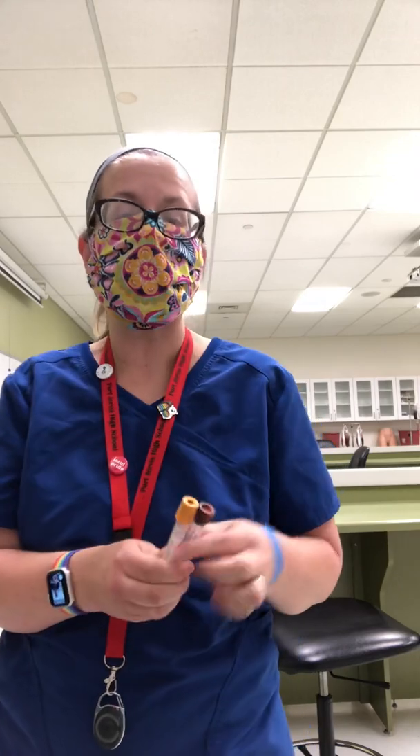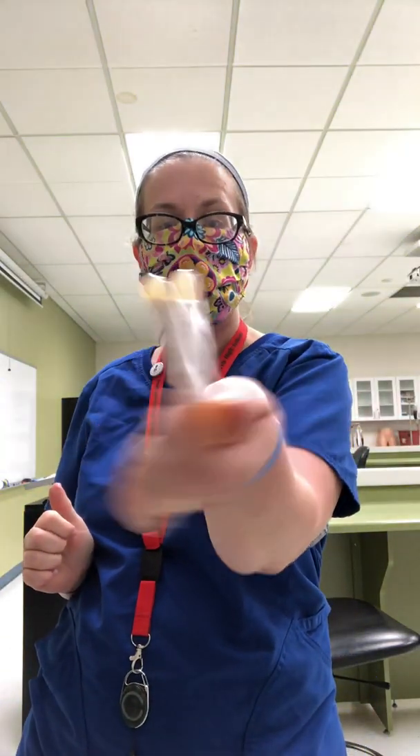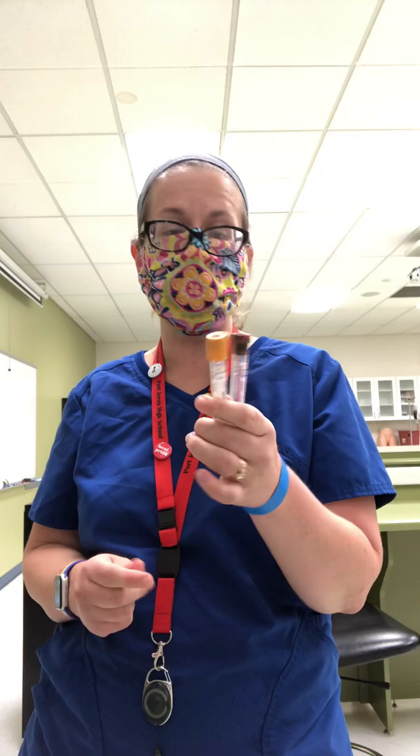Next are your gel tubes: tiger top, speckled, gold, and if you have the mint. These are serum separator tubes — you can see the gel in the bottom. Mint color is a plasma separator tube. Your chemistry panels go in here: electrolytes, cholesterol, lipid panel, thyroid panels — all go in here.